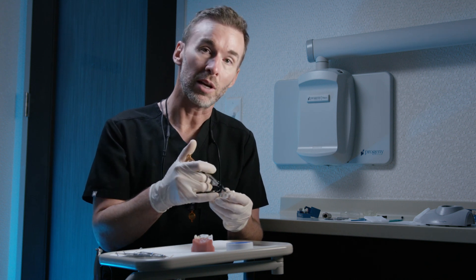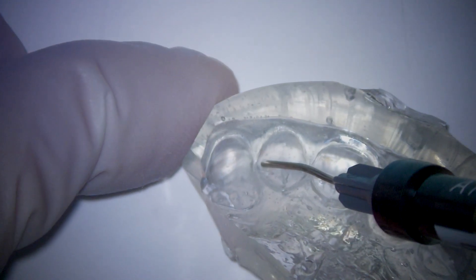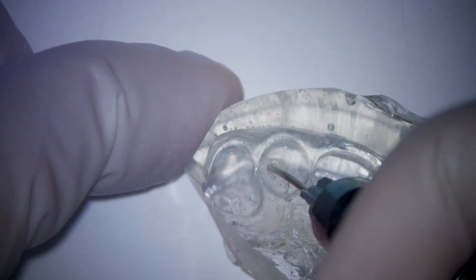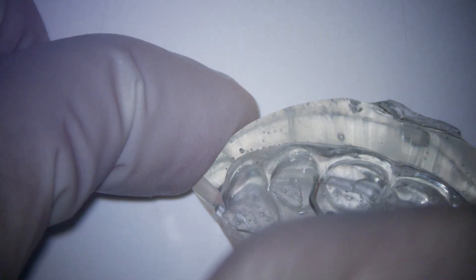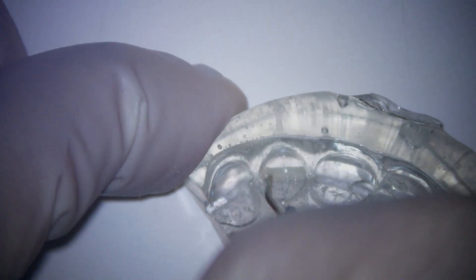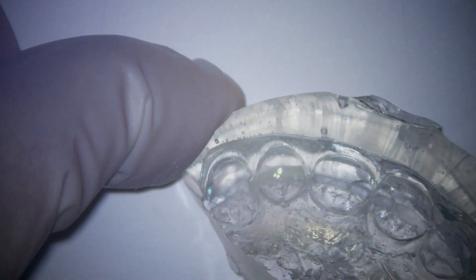As long as that is clean and clear, we are then going to preload the corners and the incisal edges of our matrix. Using this tip can really save you a lot of trouble later with air bubbles that tend to occur right at the corners of the incisal edges. What I will typically do is just preload those corners, and sometimes I'll load the entire incisal edge to ensure that we have really nice adaptation.